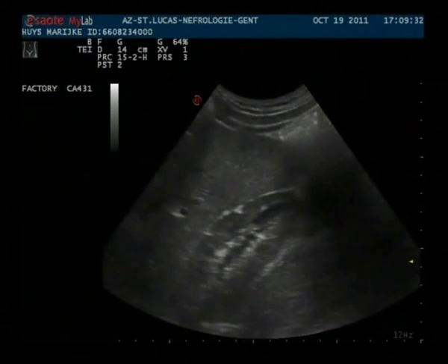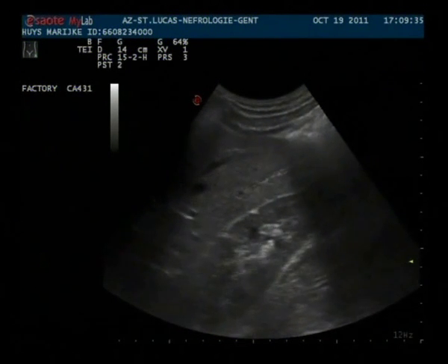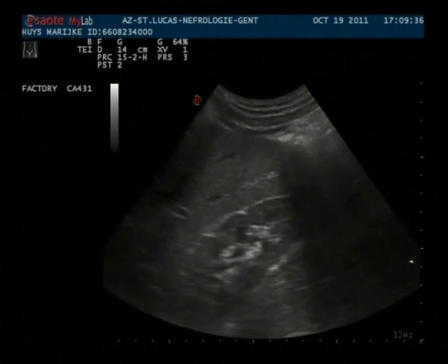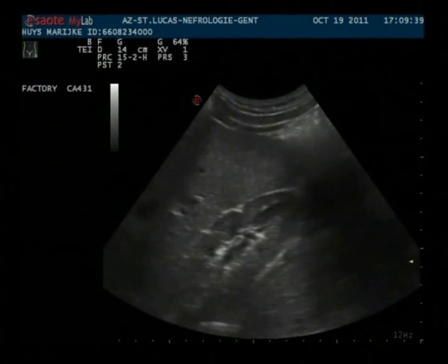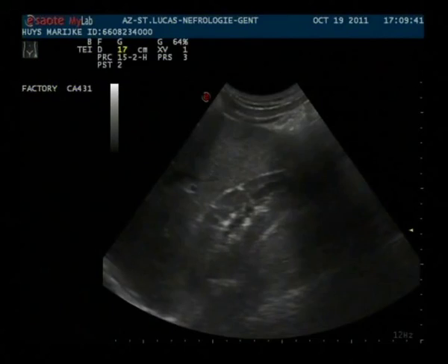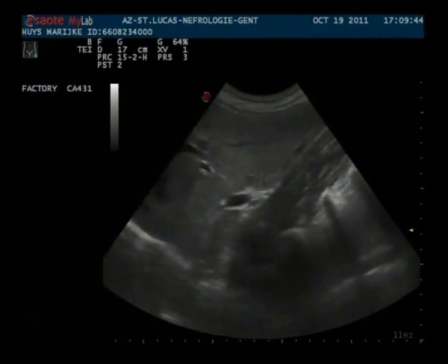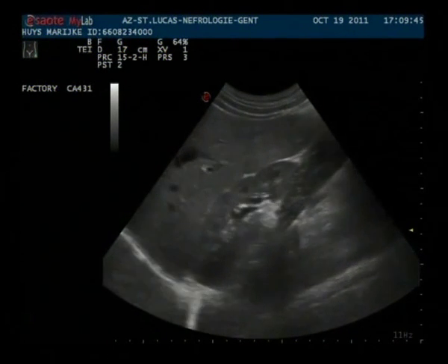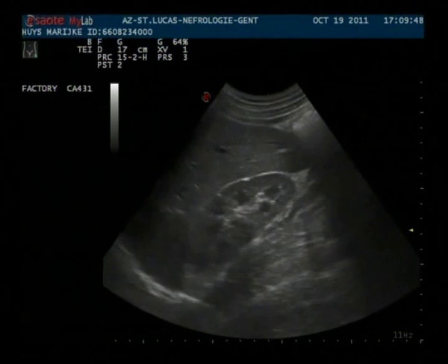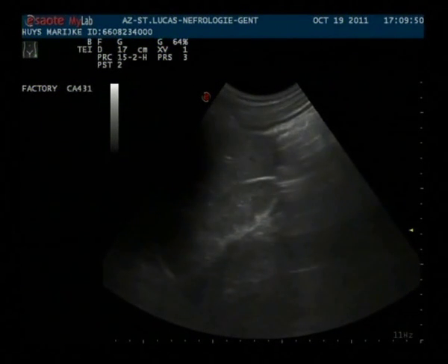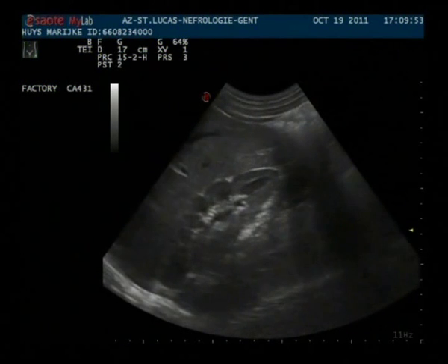In this image we see the liver with underneath the right kidney in a longitudinal axis. Normally the surface of the kidney is very smooth, but here we can see that there are several indentations, and these are sequelae of pyelonephritis.